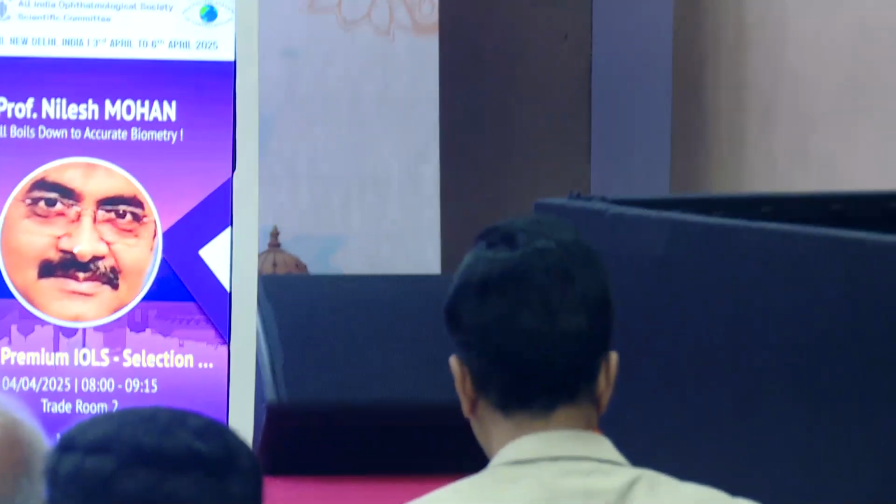One thing which I wanted to ask is about posterior keratometry, like in IOL Master 700, which is an upgradation from the 500. How important do you think it is for us to use in our day-to-day practice? Because we all know by now that posterior keratometry is important, but it's not very affordable by everybody. So how important is the role of IOL Master 700 for posterior keratometry?